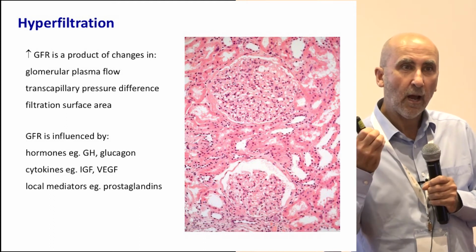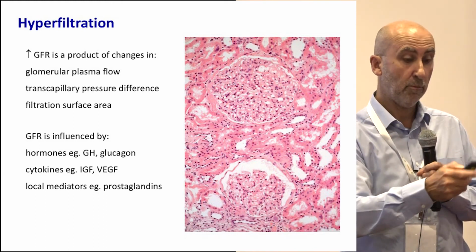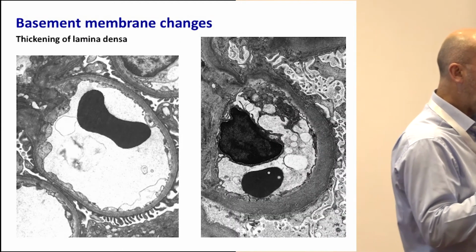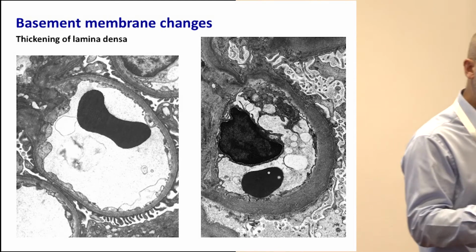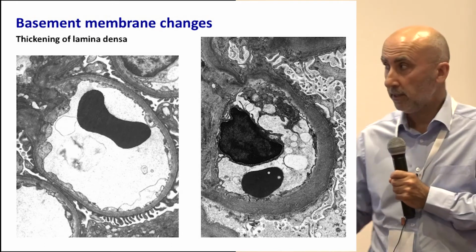The kidneys, as the nephropathy progresses, tend to shrink. But even at end stage, the whole kidneys are pretty much normal size. The first real detectable feature of a diabetic glomerulopathy is seen on electron microscopy, and that is thickening of the glomerular basement membrane.